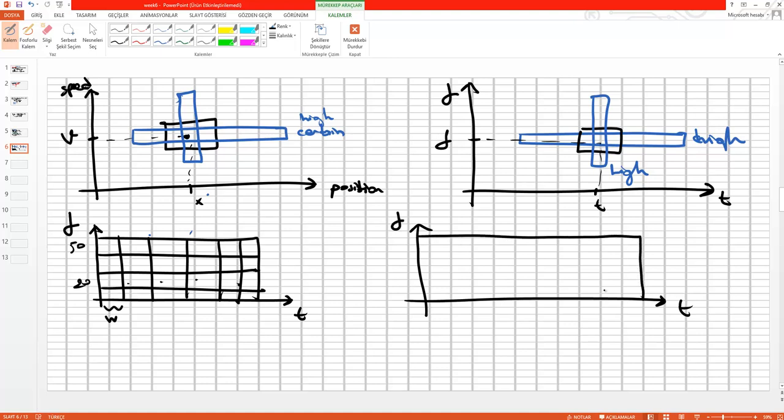And so, for example, in the first place, we can split the time to frequency like this one. But in the second case, we can divide our range like this one.